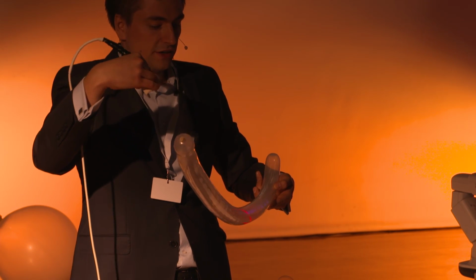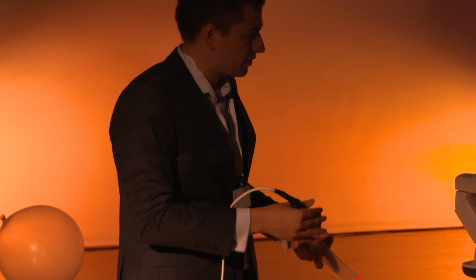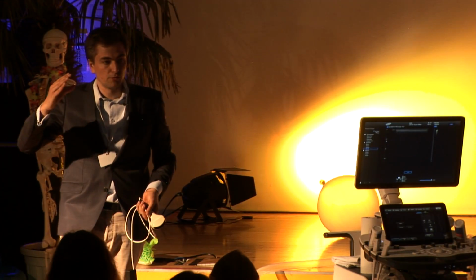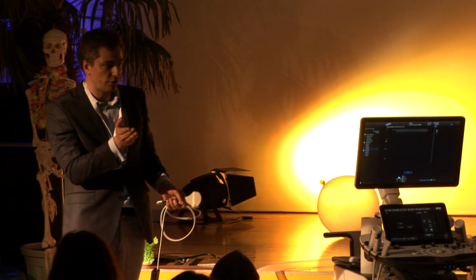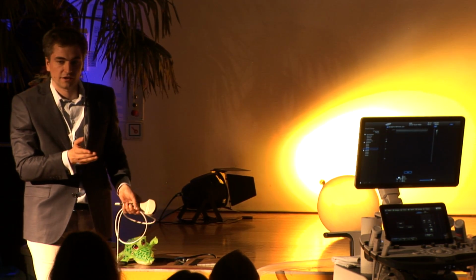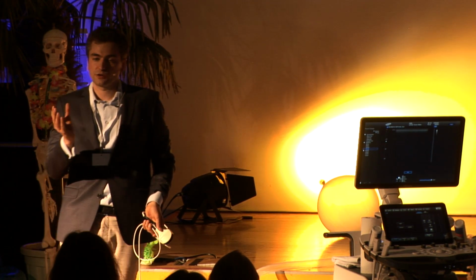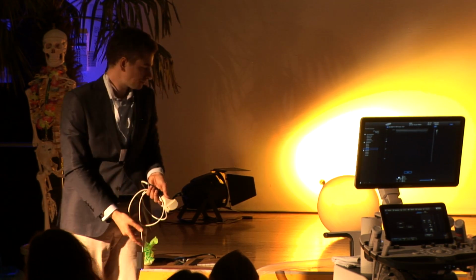It's not that easy for me to have this structure in a certain plane. And it's the same if you go to this ultrasound machine and try it on your own to find a structure. You have to remember all the time, that is what probe handling is about. Moving the plane so that you have a structure in this certain plane you generate with your ultrasound beam. And then just move in one axis with really controlled movements so that you can all the time follow the structure.